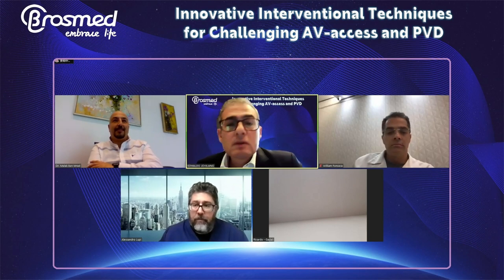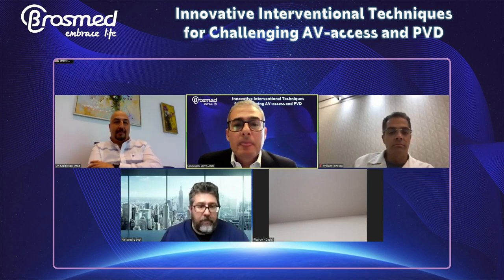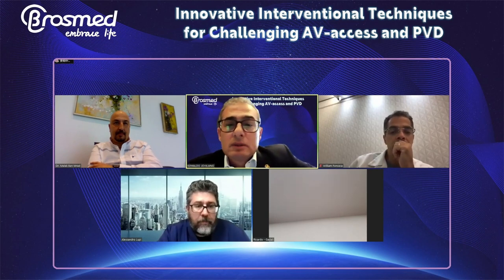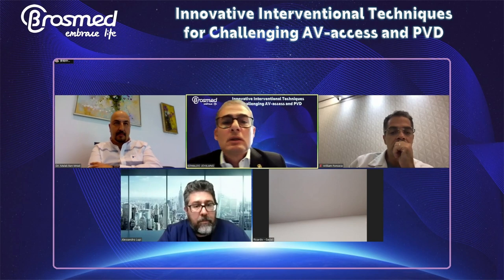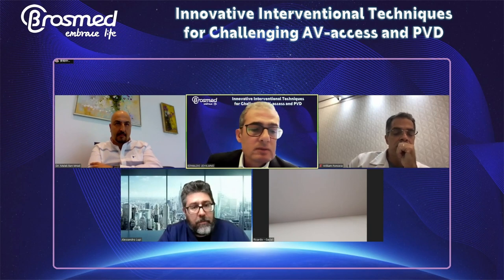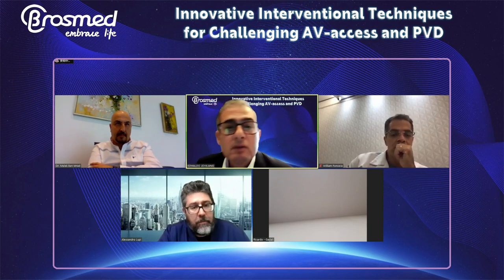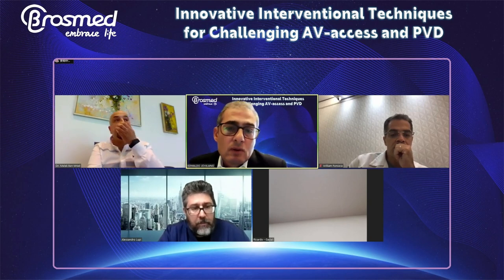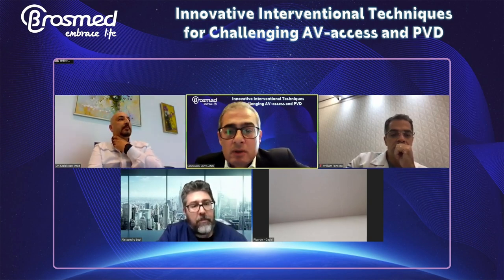Dr. Alessandro, I have a question for you. I saw that you tried to do the angioplasty first with the plain balloon before using a Tri-wedge to prepare the vessel. In your actual experience, for these complex lesions, have you used a Tri-wedge balloon as the first option to prepare the vessel, or do you always try to use a plain balloon first?